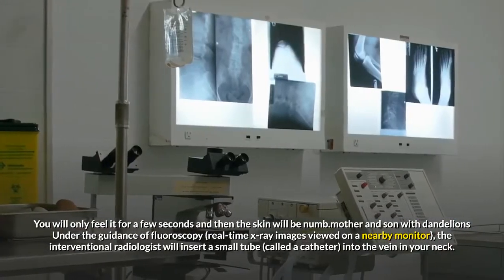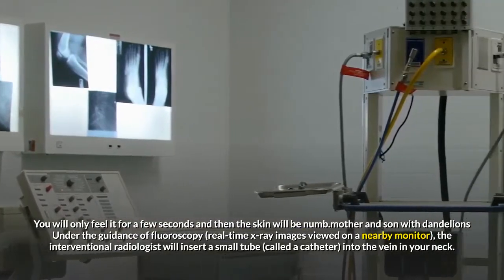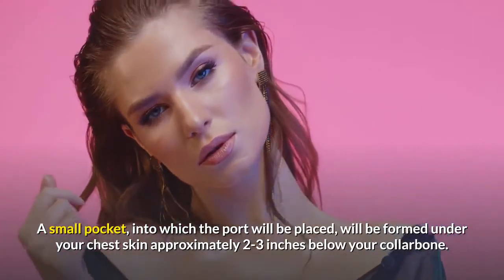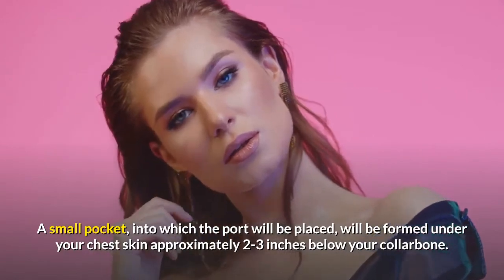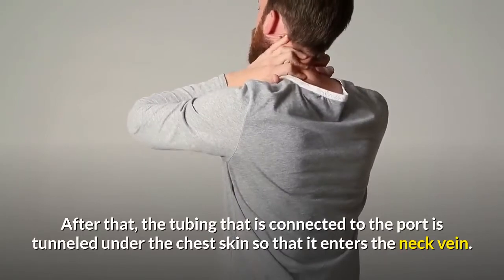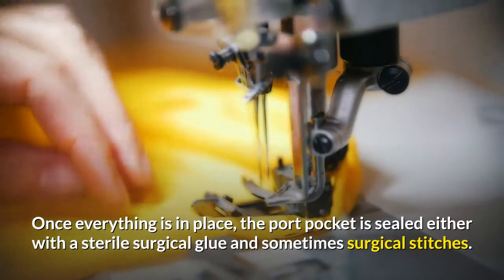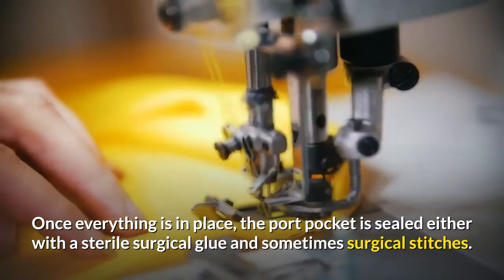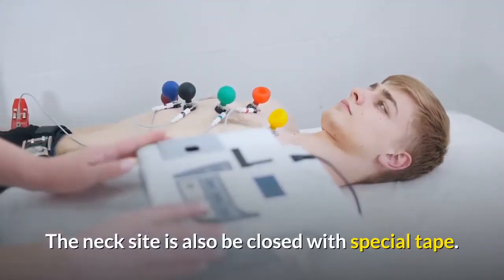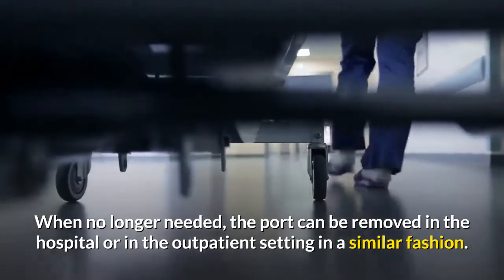Under the guidance of fluoroscopy, real-time x-ray images viewed on a nearby monitor, the interventional radiologist will insert a small tube, called a catheter, into the vein in your neck. A small pocket, into which the port will be placed, will be formed under your chest skin approximately 2-3 inches below your collarbone. After that, the tubing connected to the port is tunneled under the chest skin so that it enters the neck vein. Once everything is in place, the port pocket is sealed with sterile surgical glue and sometimes surgical stitches. The neck site is also closed with special tape. When no longer needed, the port can be removed in the hospital or in the outpatient setting in a similar fashion.